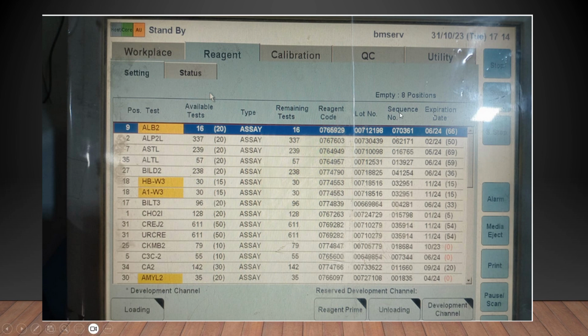During that time, the call to continue or not to continue is mine, so you will not have to bother. But remember that when the reagent is open, the expiry date is different from the reagent which is not yet open. When it is opened, we call it the onboard expiry. During that time, for any error in the testing or any problem that happens, the company will be held responsible, and they will take action based on that.